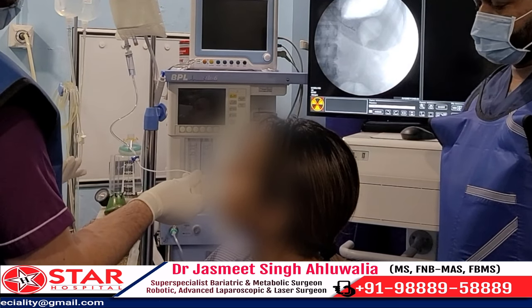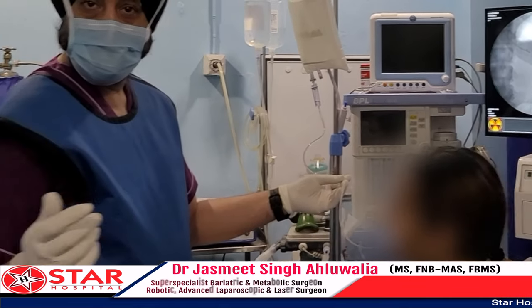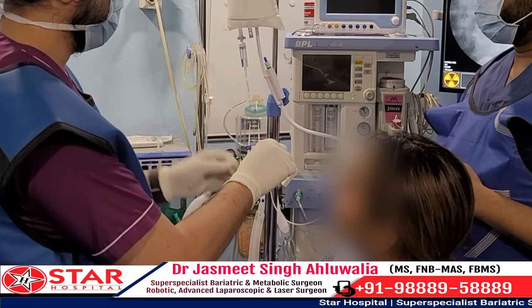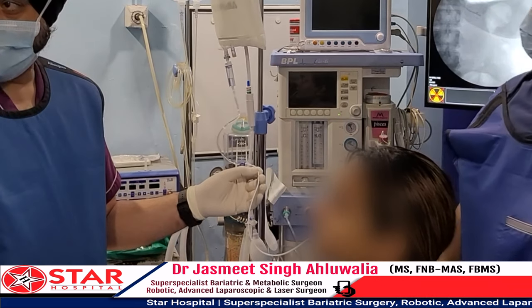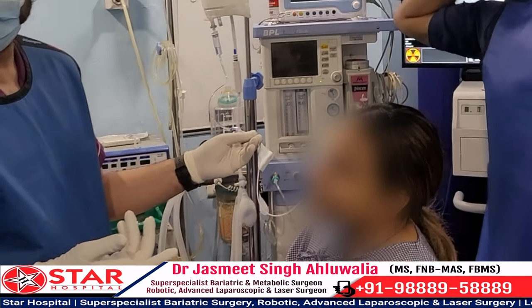A family member — her husband — is also watching the procedure. Her husband had previously undergone bariatric surgery with us, and now he has brought his wife to get this Allureon balloon placed. We are talking to the patient and explaining to her how this balloon works.